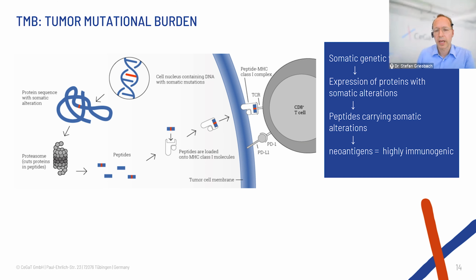We're looking into something like distinguishing 8 somatic mutations per megabase from 15 mutations per megabase or 12 mutations per megabase. And when you have a target region which is only half a megabase in size, and you have to make sure that the tumor-driving mutations are not part of that setup, what we actually end up with is 2, 3, 4 mutations as an expectation. And you can easily see that with a stochastic approach, one more or less variant makes a big difference here. If your coding region is sufficiently large, one additional sequence will not make that big of a difference, and therefore we can safely determine the tumor mutational burden, if it's high or low.